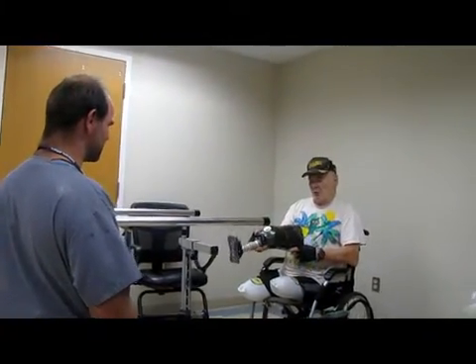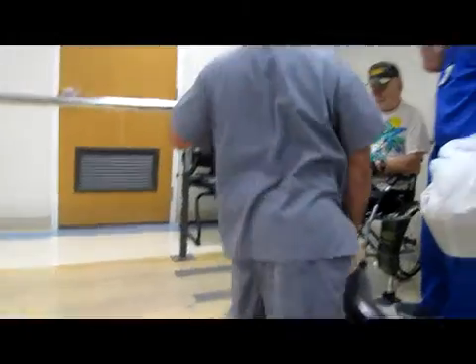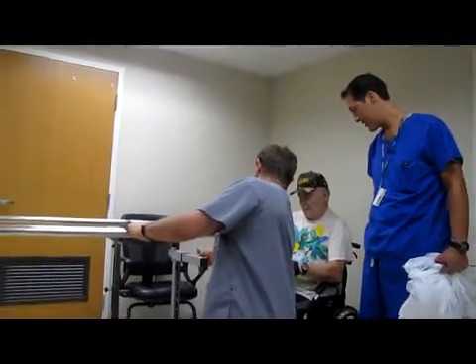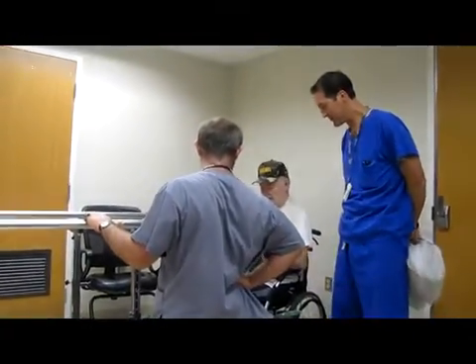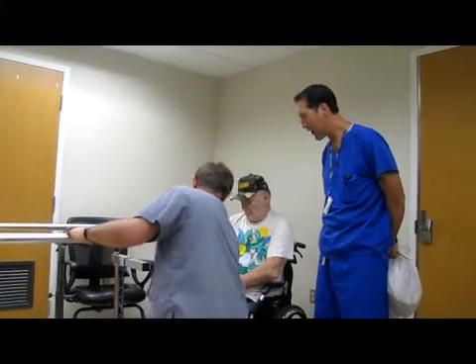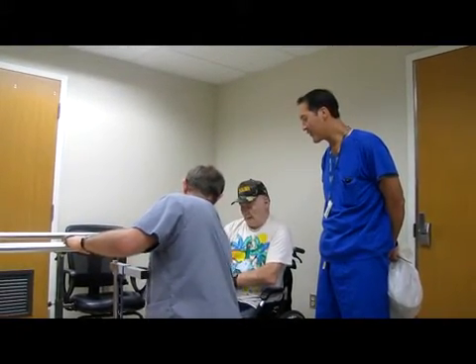How does one know which one is which? Well, offhand, you know, we could label them. Your right leg is larger. Yeah, red's in the front. For me, the red goes in the front, and the valve goes on the inside. Right, but I meant this would fit on which leg? See, so you want the valve to be towards the inside of your leg. So then this should be for the right leg? Correct. You gotta go the right way.